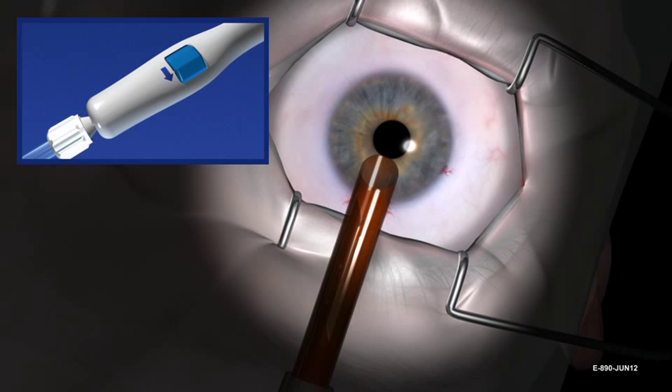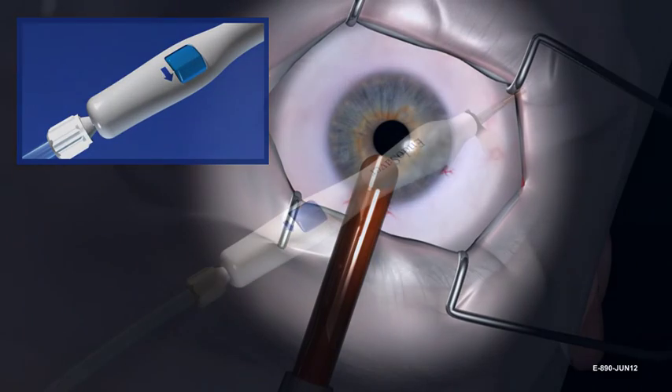Continue rotating the blue thumb screw only in the direction indicated by the printed arrow until all action stops. Then rotate three full revolutions past the point where tissue is observed to be fully retracted. You cannot over-rotate the blue thumb screw — it will free spin.